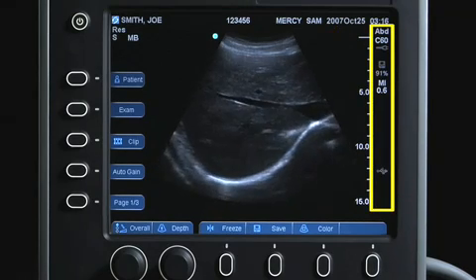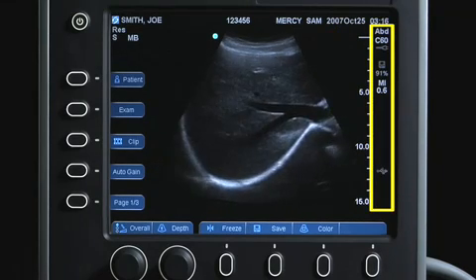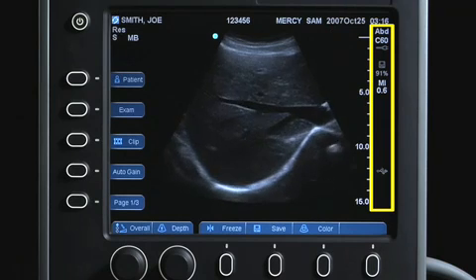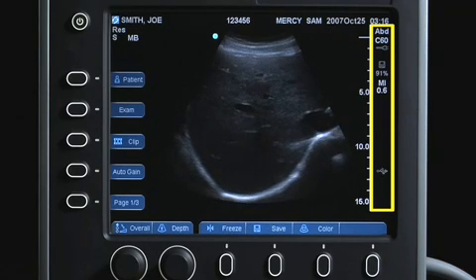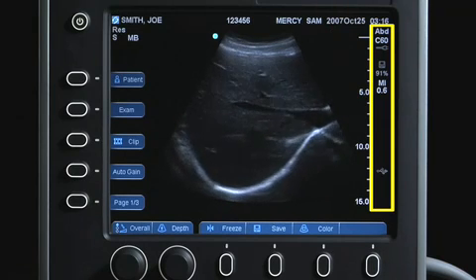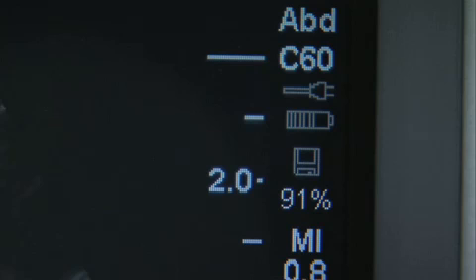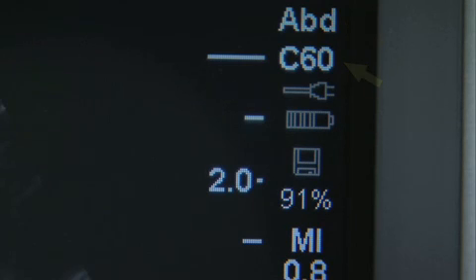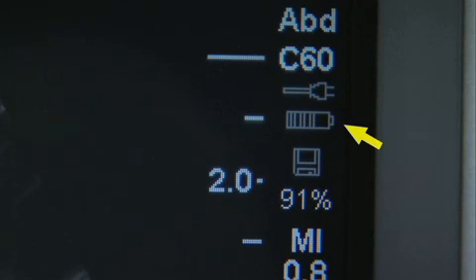The symbols displayed on the right of the screen provide information about system status. There is information on the exam type, transducer, AC connected, and battery level.